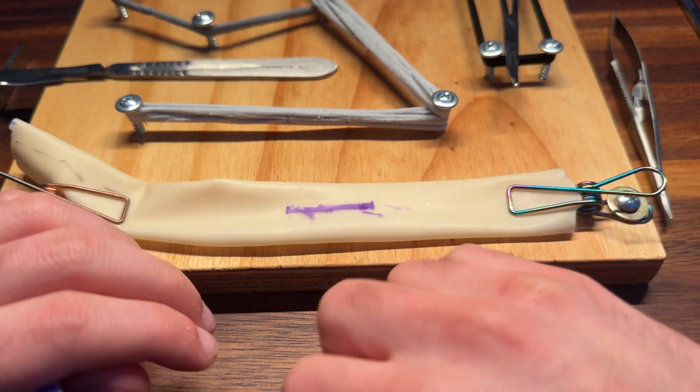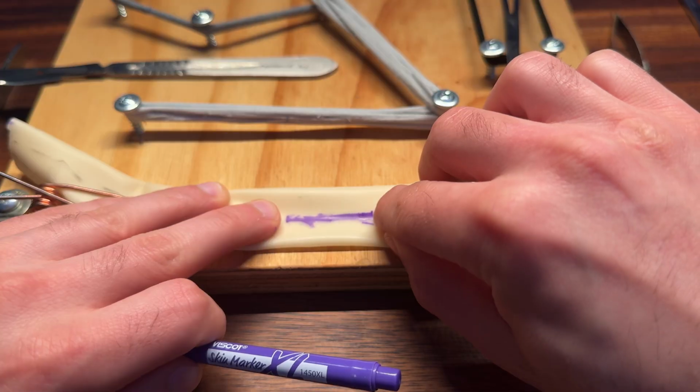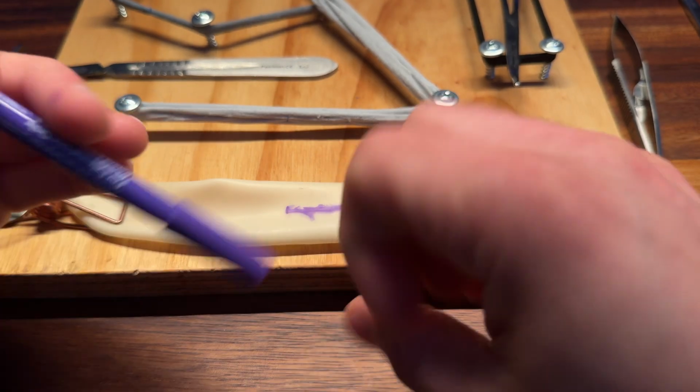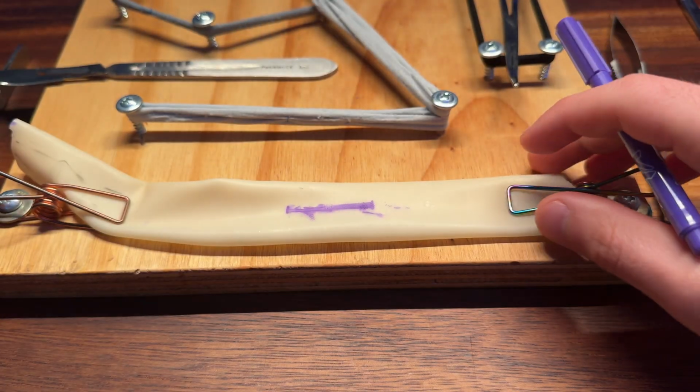Don't mind these smudges here, but first, for preoperative planning, I need to figure out how big this incision is, because whenever I make my actual patch, it's going to dictate how big I make it. So in this case, it's going to be about 3 centimeters or so.